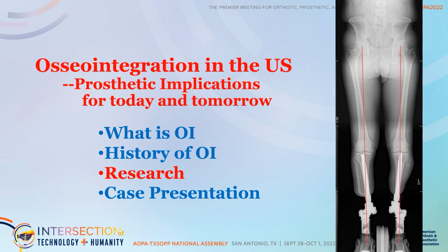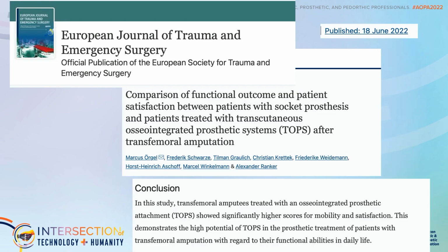So we talked a little bit about what it is. I'd like to tell you a bit about the proven benefits. You probably have heard some patients read about things on Facebook, and sometimes it sounds almost zealous, religious, in the way people talk about it. There's a science behind this that I hope people will be able to understand now, because we've been doing it for over 20 years in Sweden, and they've been doing it about 10 years in Australia, so there's data behind this, not just patient cases.